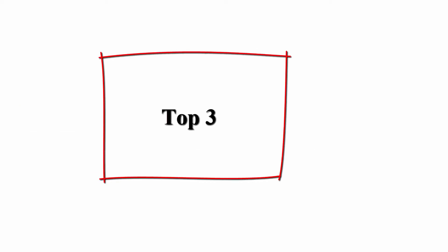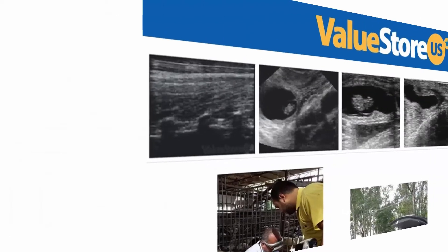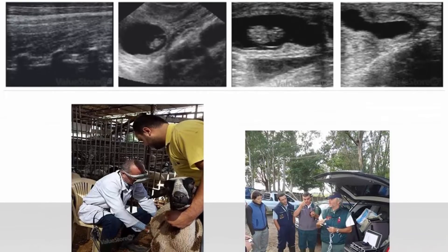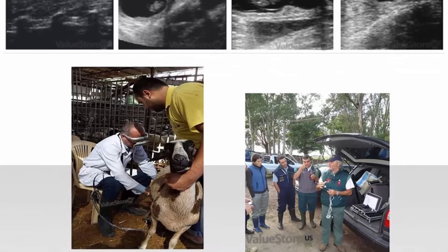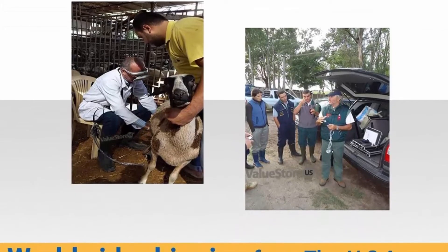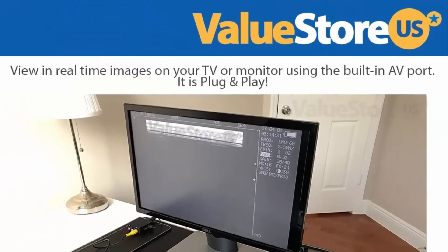Number 3: Portable Ultrasound Scanner Veterinary Pregnancy V12 with a 3.5 MHz convex probe for sheep, dog, cat, and pig. Perfect for small and large pregnant animals like pigs, sheep, and dogs. Its rechargeable battery makes it convenient to carry. A silicone case with belt allows indoor and outdoor use, protecting it from falling during a diagnosis with an unexpected move.